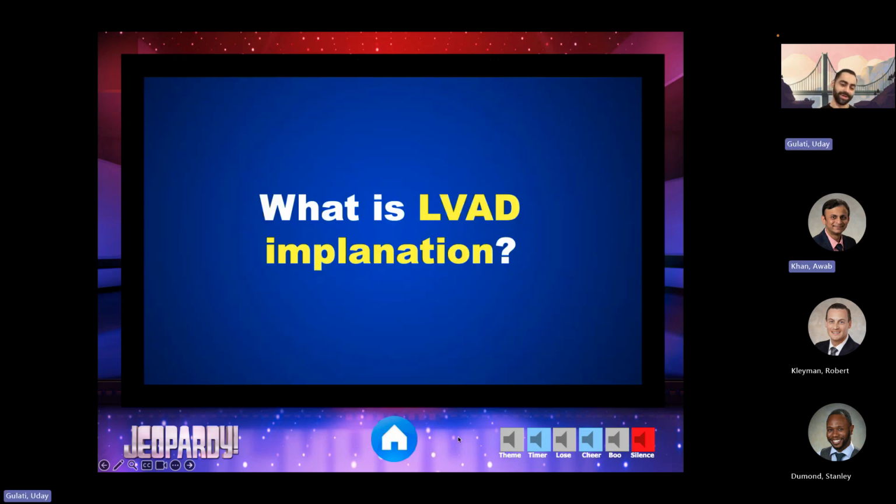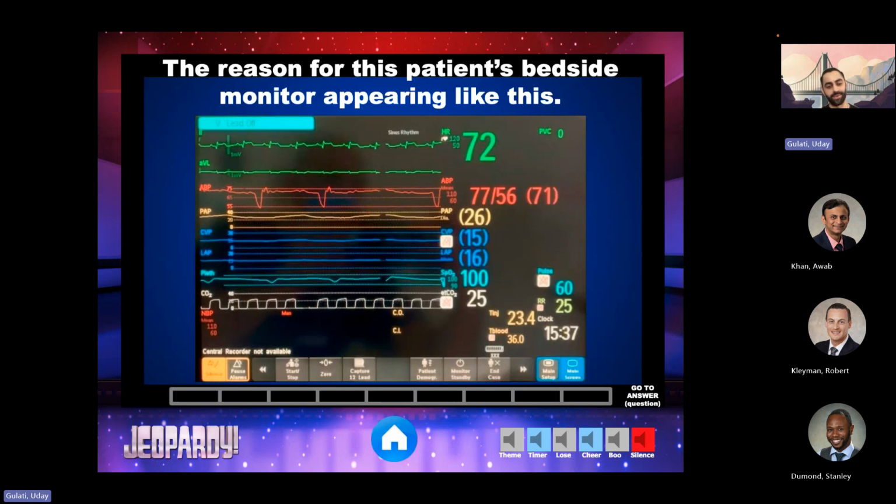It is because the patient has an LVAD. They have a heart rate. This is an A-line in a patient with an LVAD. You guys want to try and figure out why that would be? So you get continuous flow. But why would it all of a sudden generate a single beat?